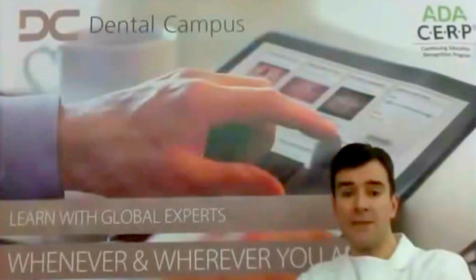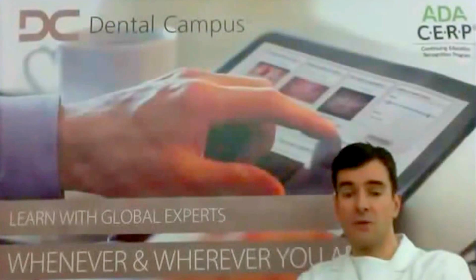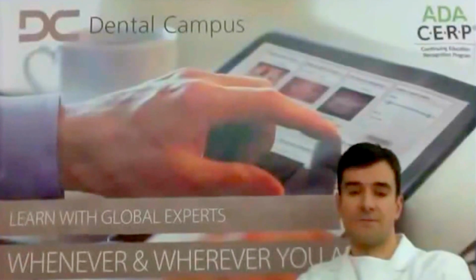How deep do you place it? When you place the implant, you would like to have at least 3 millimeters from the implant shoulder up to the superficial surface of the mucosa.